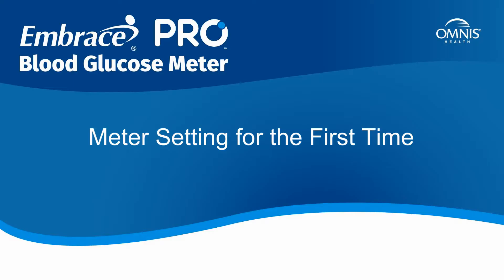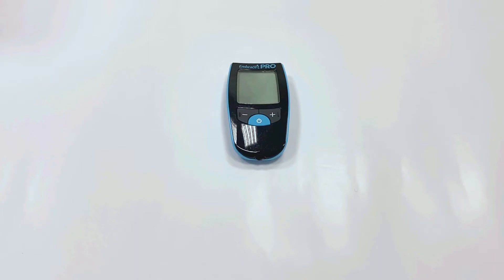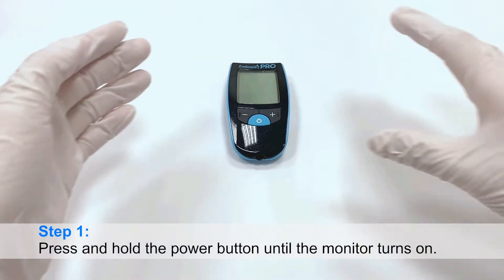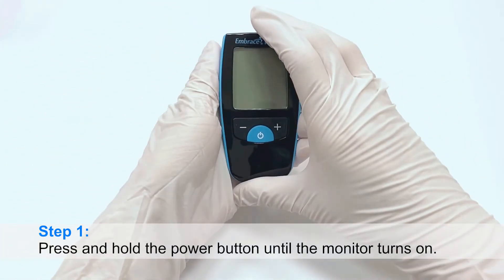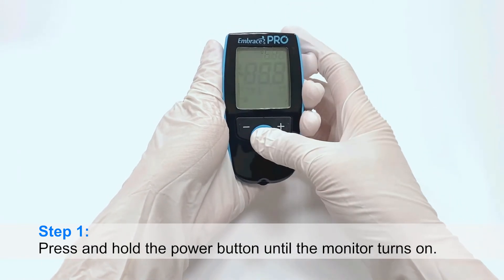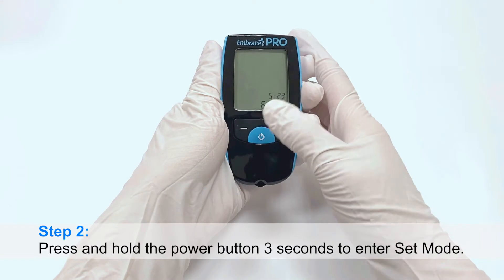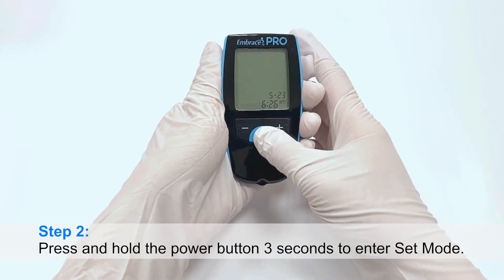Meter setting for the first time. Step 1: Press and hold the power button until the monitor turns on. Step 2: Press and hold the power button for 3 seconds to enter set mode.